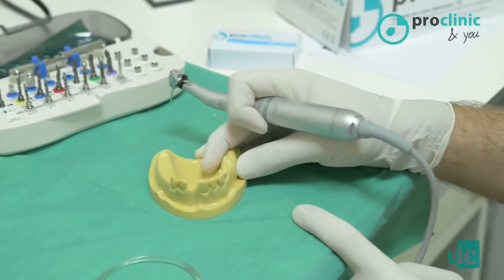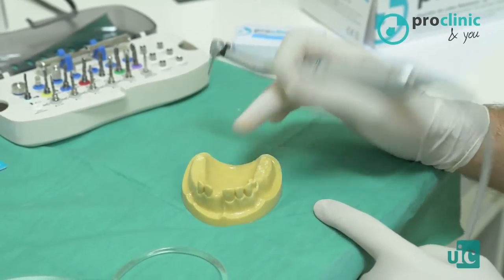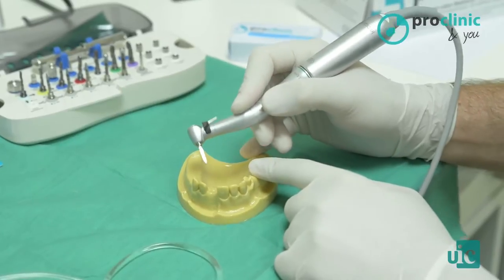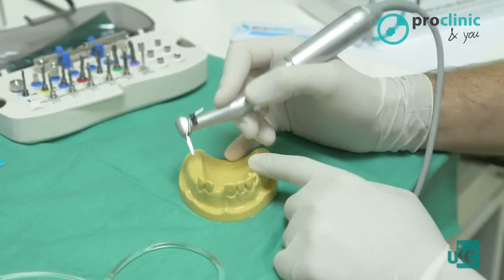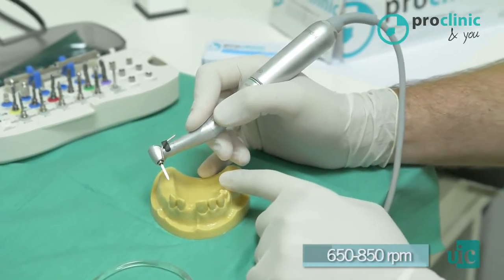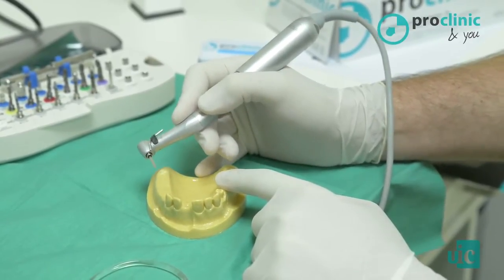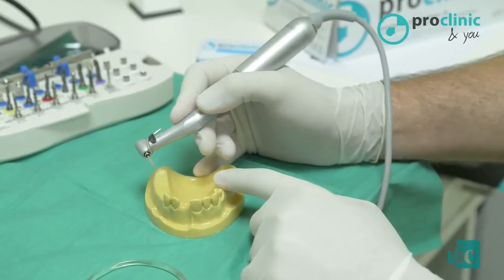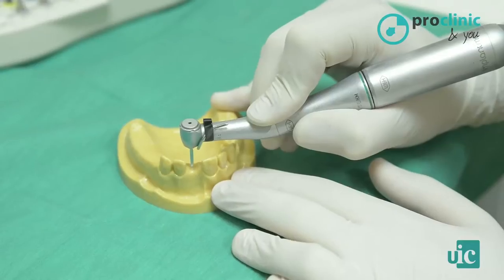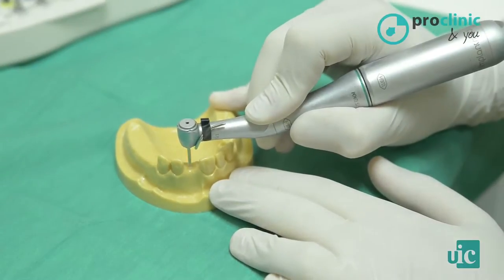Because it is the upper central incisor area, the implant position has to match the cingulum of the incisor, and we should take care of the adjacent teeth and vestibular bone. We usually drill from 650 to 850 RPM under saline irrigation. In this particular case, as we are working only on a phantom model, we are not going to use any irrigation. We do not need to care a lot about the implant bed angulation at this point, and we are just using the lanceolate burr as a marker.